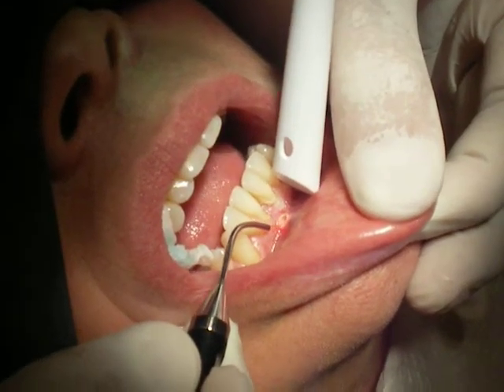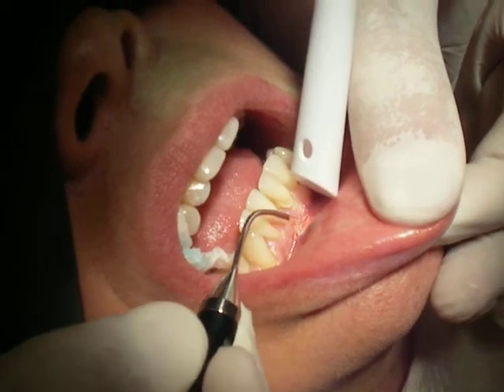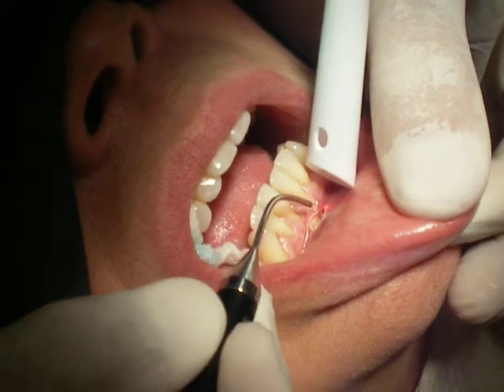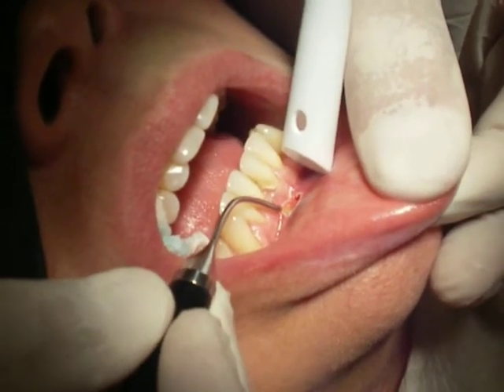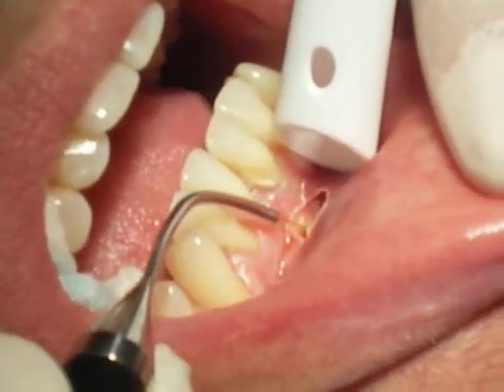This laser will properly remove this frenum to reduce the pressure that the frenum puts on this tissue, so that we can go back later and place a connective tissue graft around these two teeth to achieve a better zone of attached tissue.